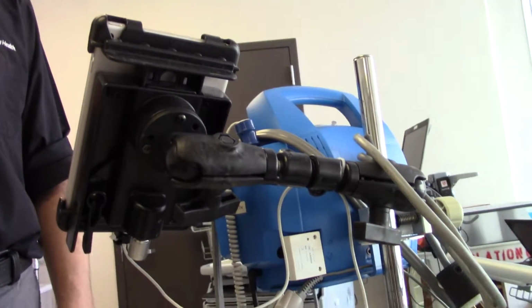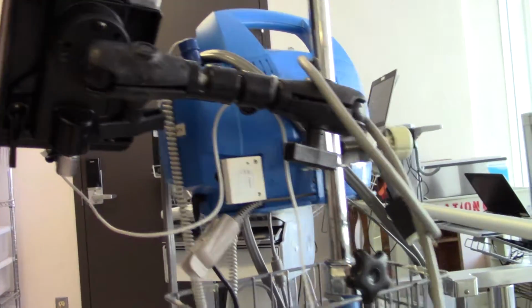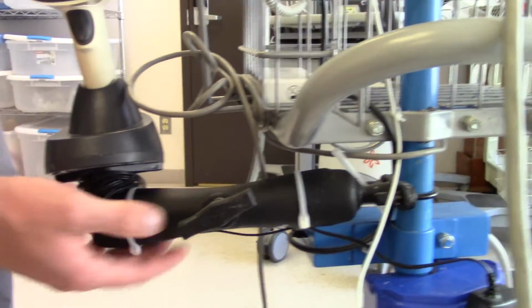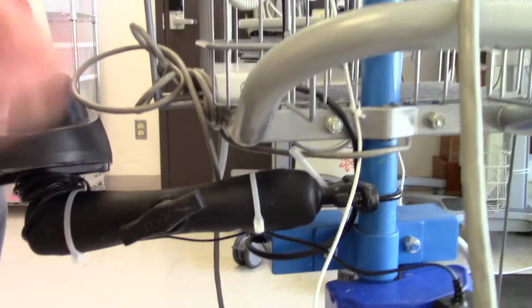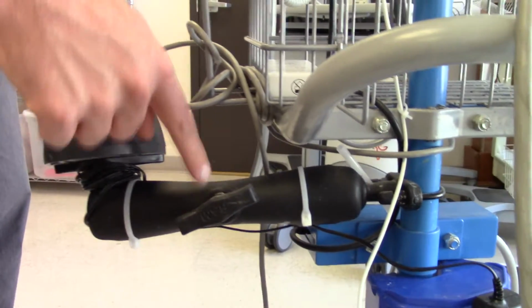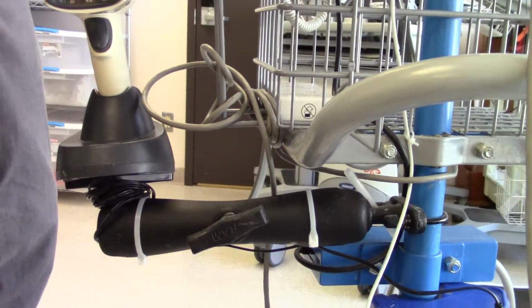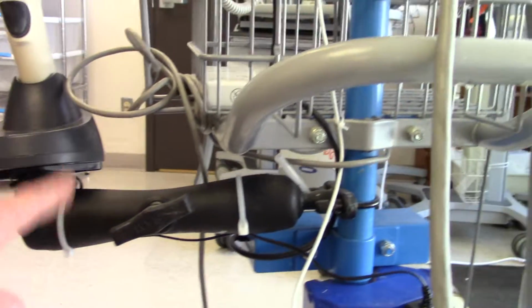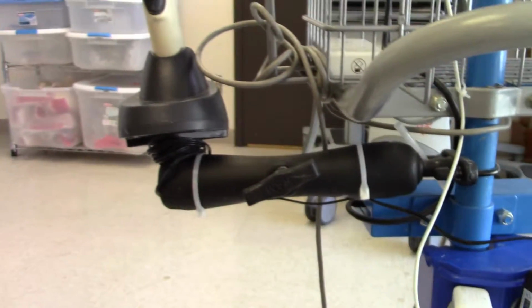Okay. Yeah, and you can see this also on the Welch Allyn. This is the rigid mount that I use for the scanner. As you can see, that's just a U joint. Correct. So probably if we had more Dynamaps, it'd be better to just grab this joint and reuse that arm. Okay, and this is made by the same company? Correct. Yeah, it's all the same.